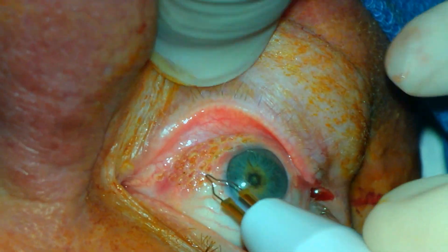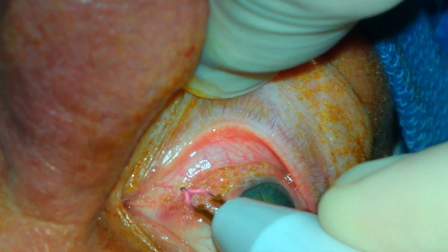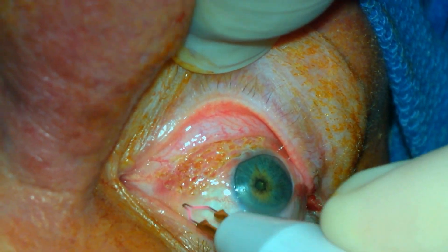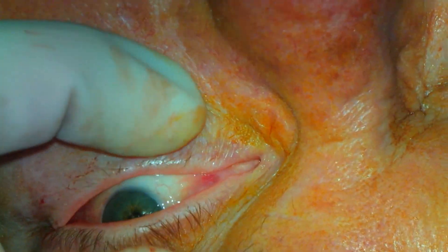The cautery is applied only to the bulbar conjunctiva and can extend to the fornix. This is usually a bilateral process, and the other eye, which did not have as much redundant conjunctiva, is then addressed.